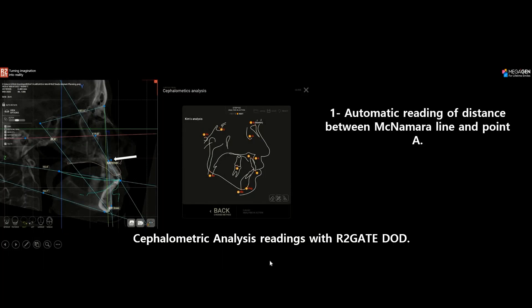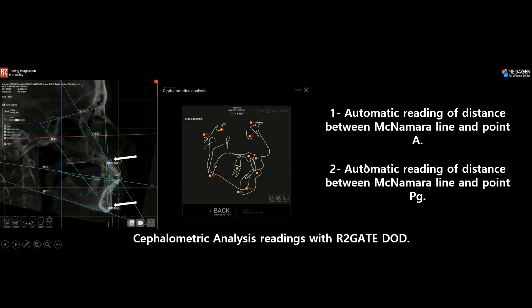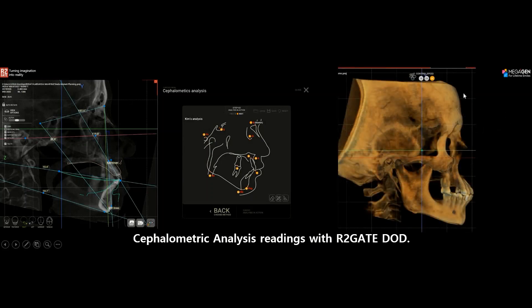In R2Gate digital oral design, you get an automatic reading of the distance between McNamara line and point A, and between McNamara line and point PG. In this case there is a 5.0 millimeter distance between point A and McNamara line — a protruded maxilla — and a 4 millimeter distance between point PG and the line — a protruded mandible. Looking at this patient's side view, we have both protrusion in the maxilla and mandible, demonstrating how cephalometric analysis helps determine the skeletal relationship and guide treatment planning.